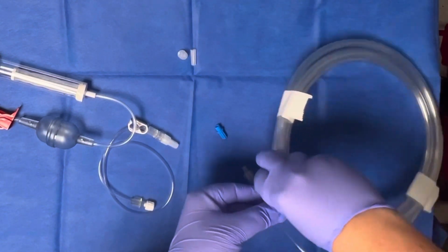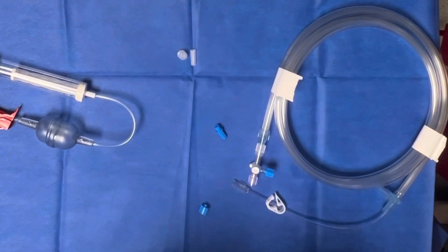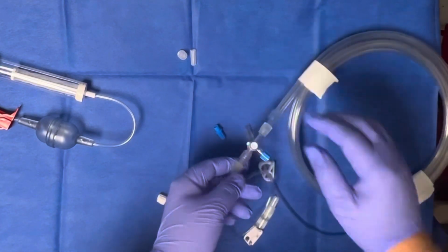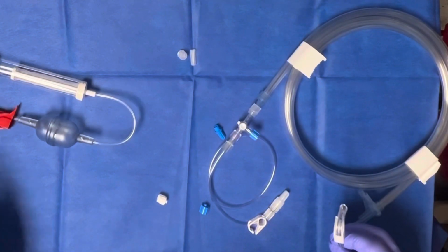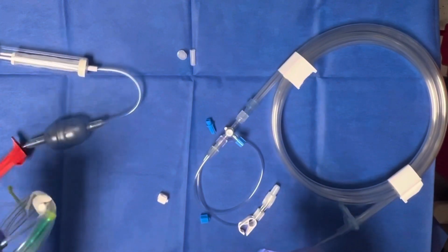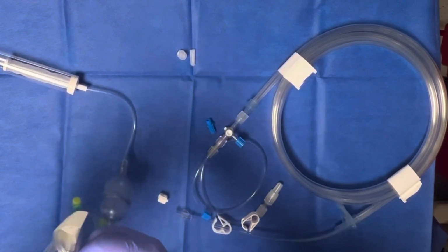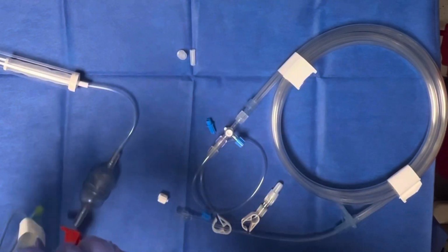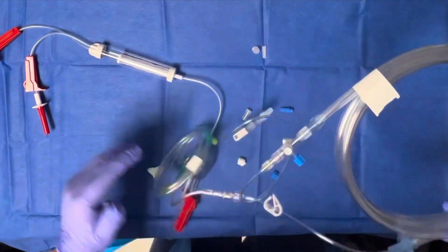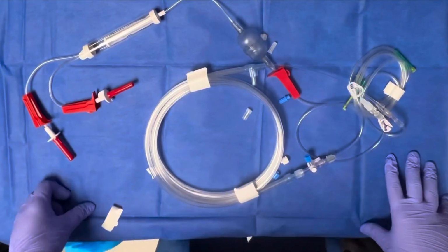Just tighten that. Okay, next we're going to attach our extension to the stopcock. Tighten that, just like that. And then we're going to attach our blood tubing to this longer extension right here, to the coil tubing. And just like that, you have your fully assembled dry line ready to be spiked.